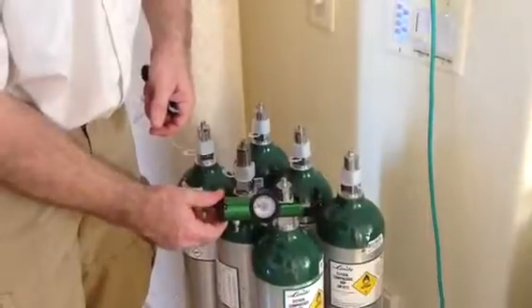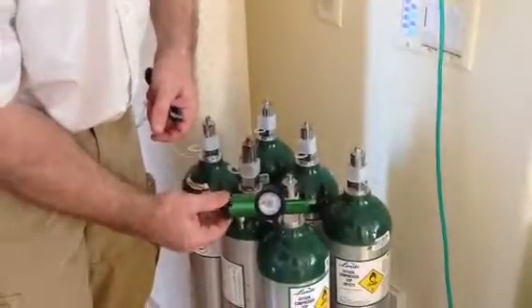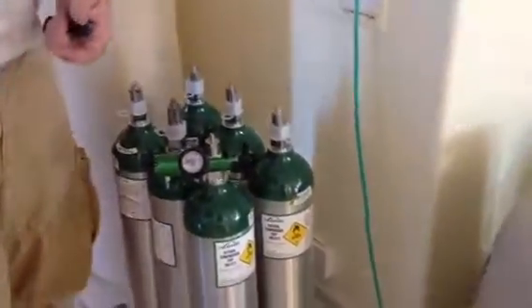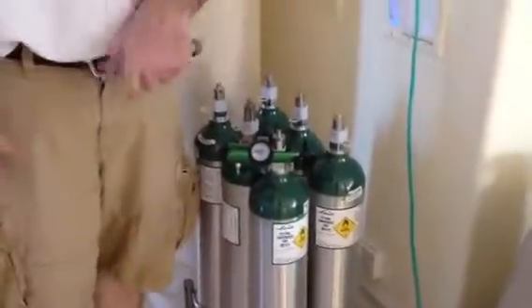Over here, you have a click-style regulator, which tells you liters per minute — exactly the same as the C41, C1000, or any other standard oxygen product.